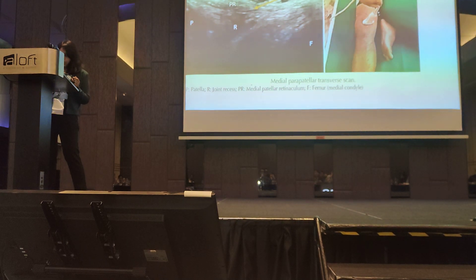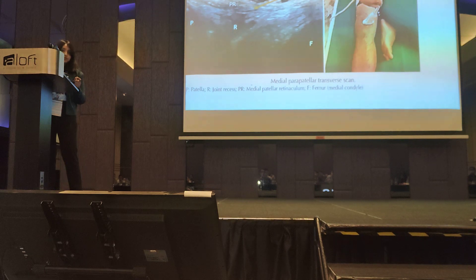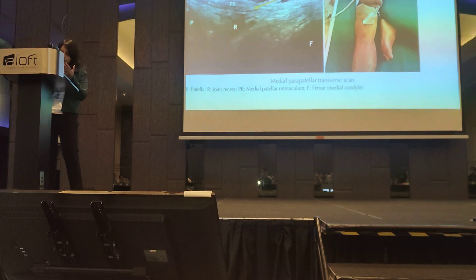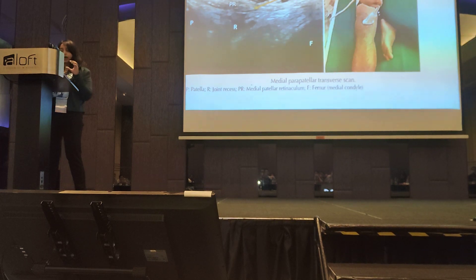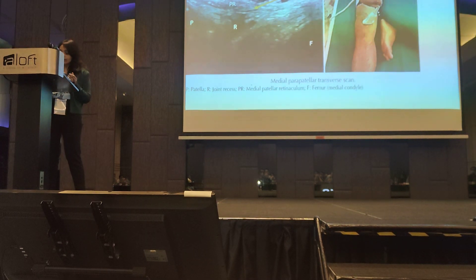Here we see the medial parapatellar transverse scan. We hold the linear probe in this direction and the yellow arrow shows the needle trajectory. We see two bony surfaces — the patella and the femur — and in between, our needle crosses through the medial patellar retinaculum, reaching the joint recess where we give our PRP and hyaluronic acid.